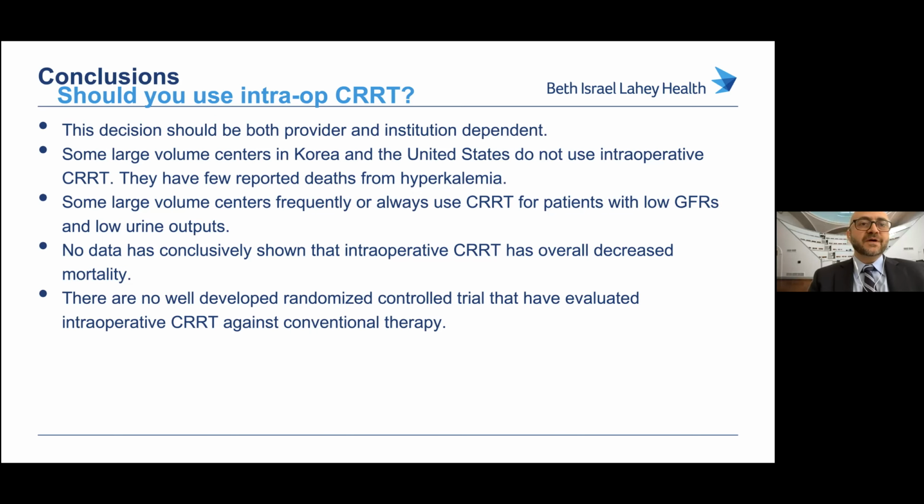The first question is, do you have any difficulty maintaining temperature with CVVH? If so, how do you mitigate it? So I just saw a gentleman in preoperative clinic on Friday. He had a BMI of 18, and he had a very large belly full of ascites. So he's all skin and bones. His creatinine was 1.4 on the day I met him.